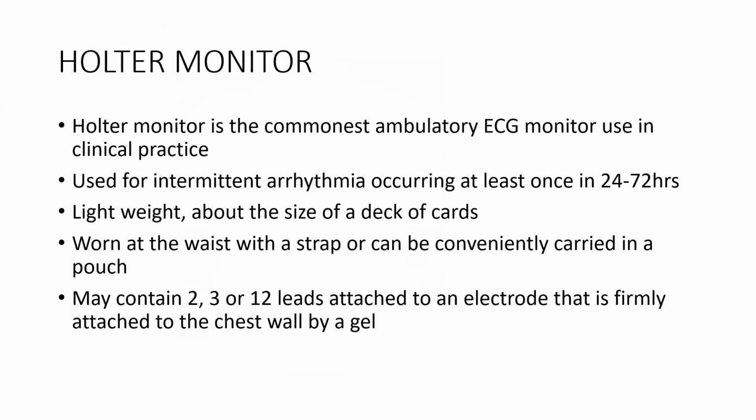Okay. So the Holter monitor is the commonest ambulatory ECG monitor used in clinical practice. It can continuously monitor and record events for about 24 to 72 hours. This modern day Holter is lightweight, about the size of a deck of cards, and can be worn at the waist with a strap or conveniently carried in a pouch. There may be 2, 3, or 12 leads. The commoner ones are the 2 and 3 lead Holter monitors.